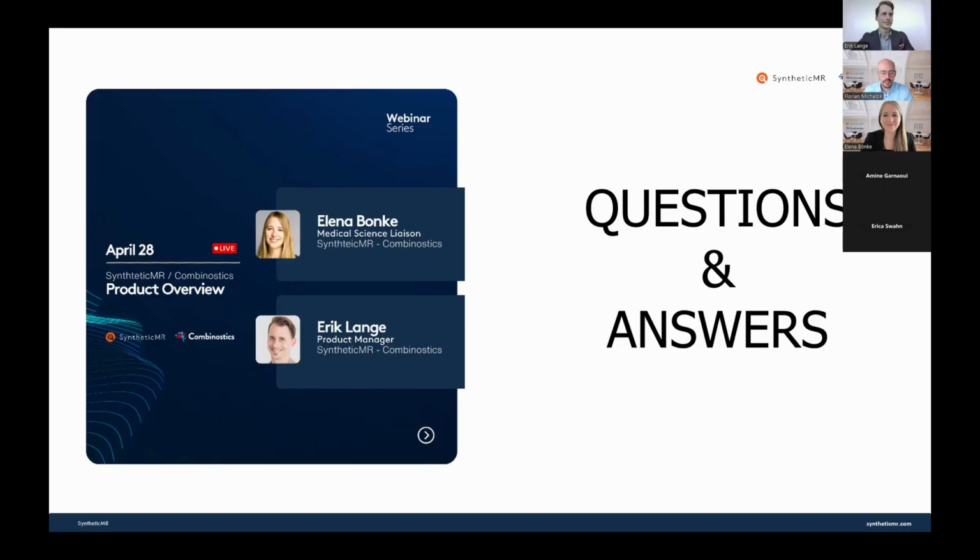Exactly. Thank you. So another question, which is interesting for everyone to know, is if a department is starting with the quantitative imaging, how much extra time does the post-processing typically add to the reporting workflow? Maybe Elena, you can go first. Yeah, to the reporting workflow.